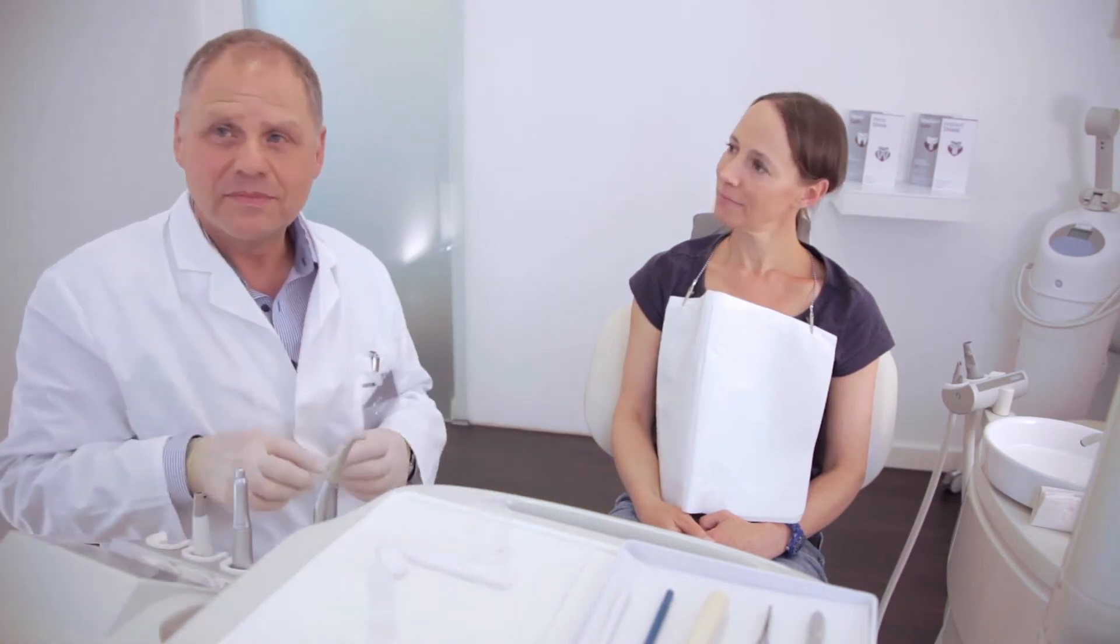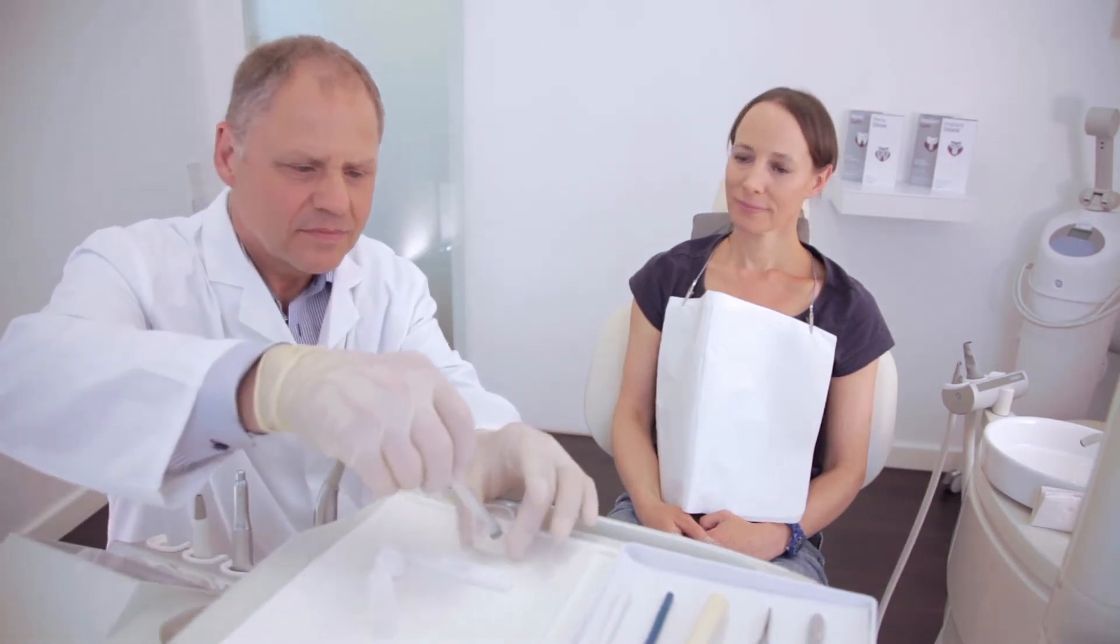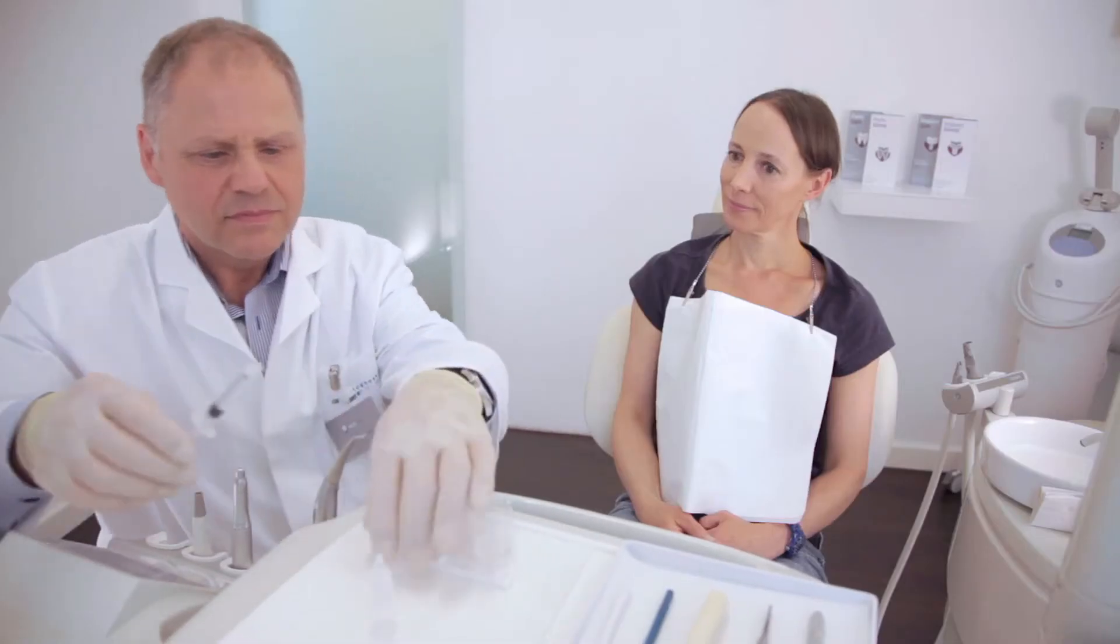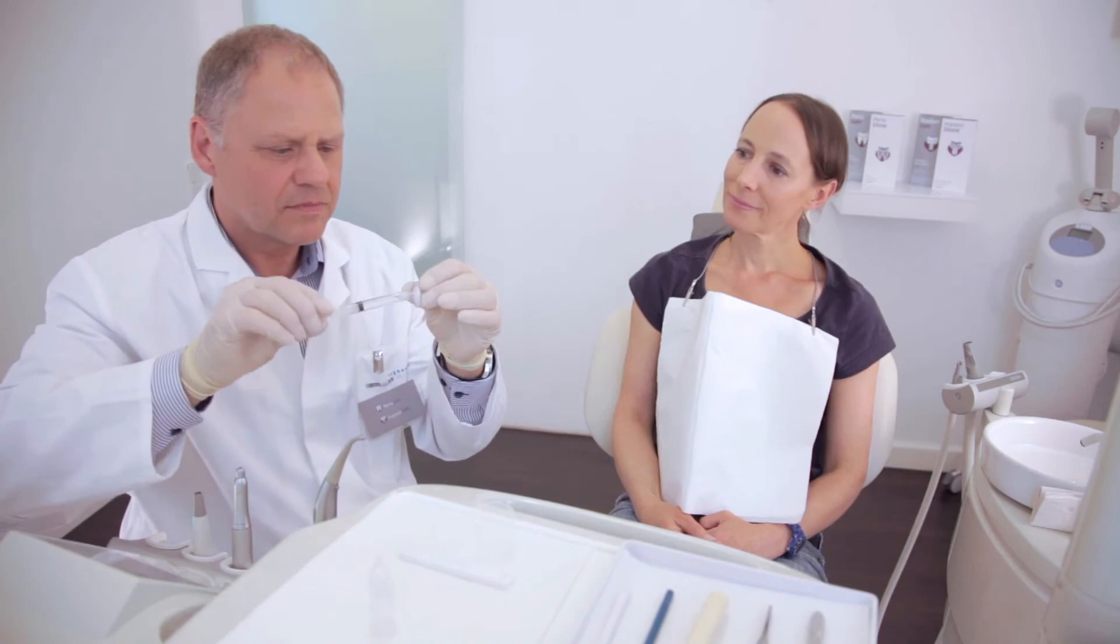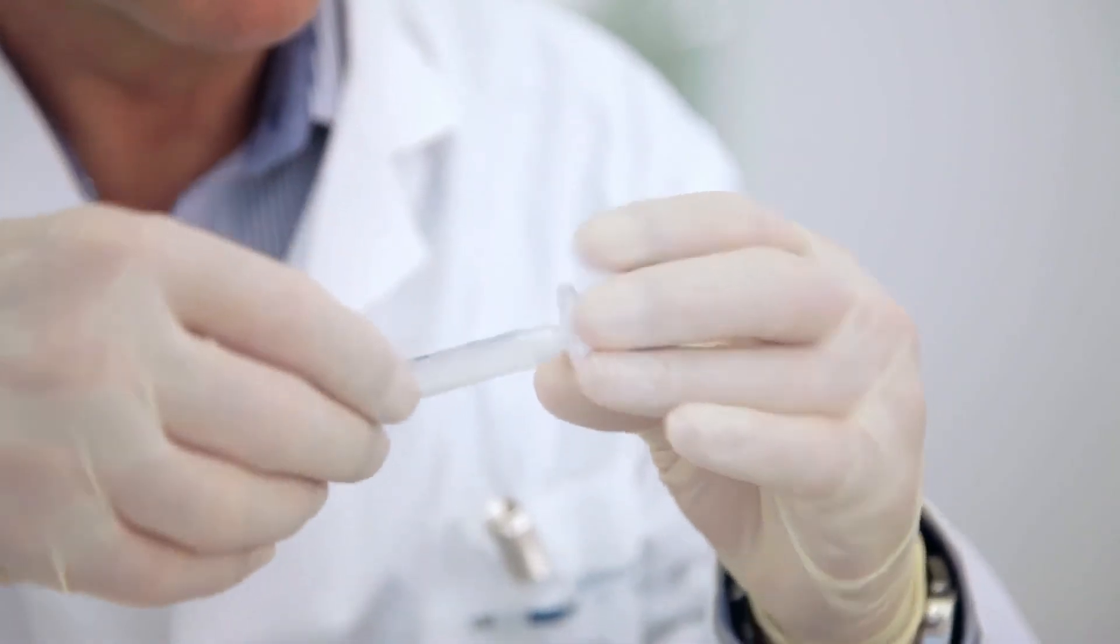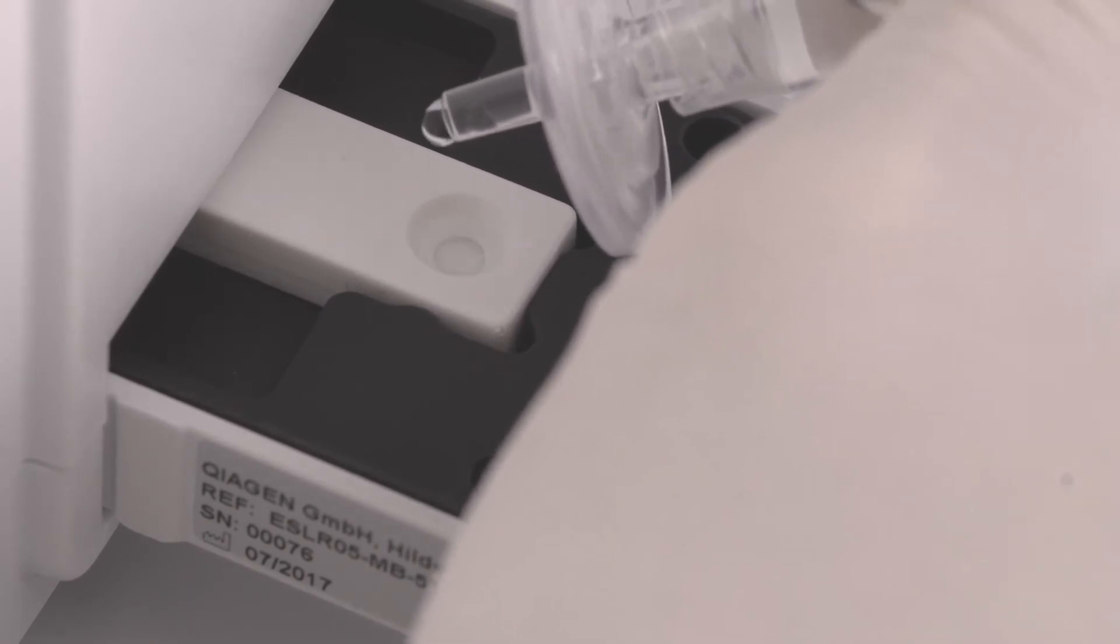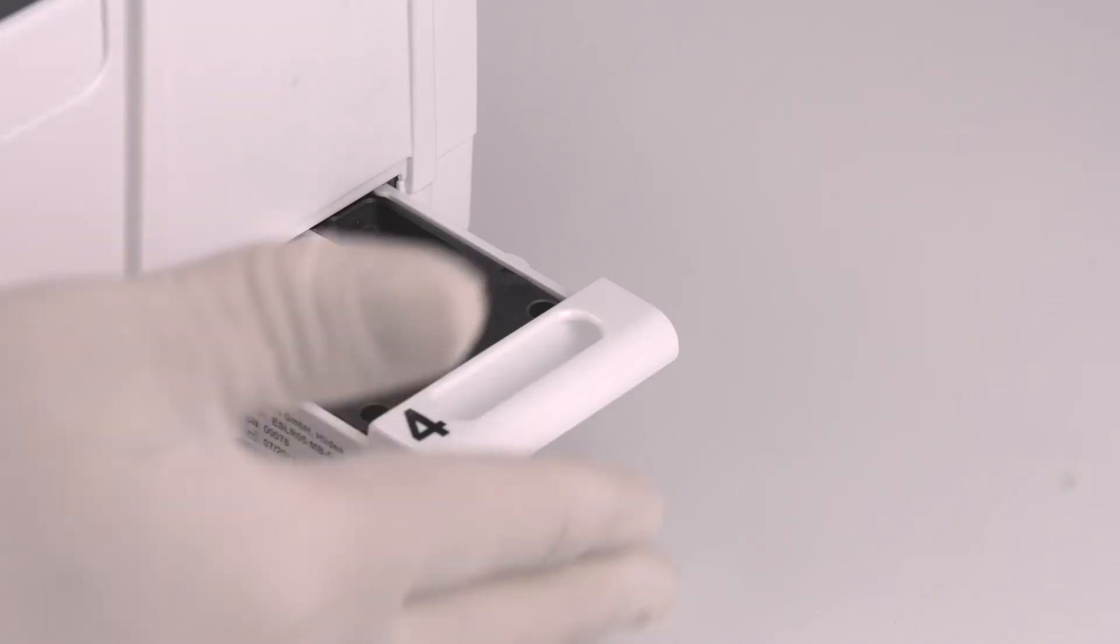Now suck up the patient's saliva sample from the cup with the syringe provided. Then attach the provided filter to the syringe by twisting in the clockwise direction. Then allow 3 to 4 drops to fall directly into the round opening of the test cassette, taking care not to stick the tip directly into the opening.